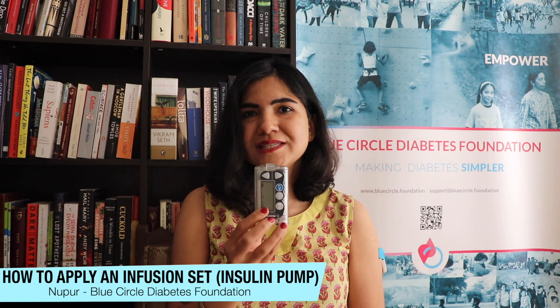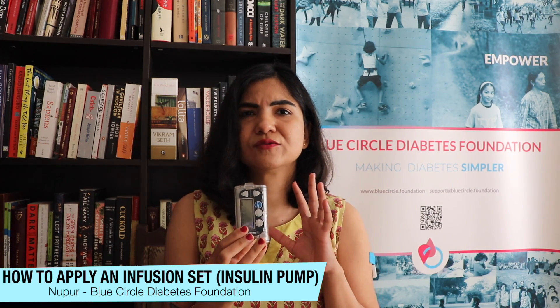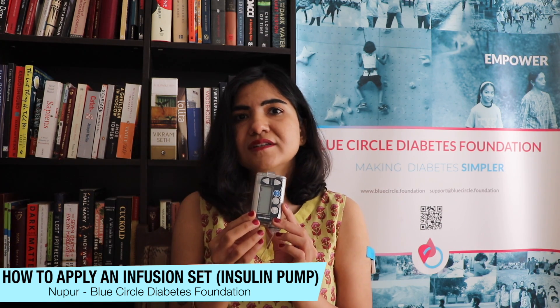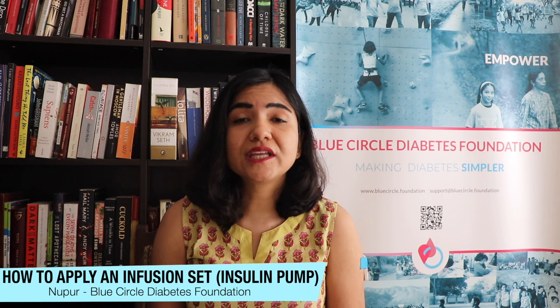This is my insulin pump — I'm using a Medtronic 722. We're not going to get into the features of different models, but this is what one type of pump looks like. It's a machine that delivers insulin, just like the syringe and the insulin pen. Here's the machine, here's a tube that connects to a patch on your body — a patch that you inject onto your body and change every three days.